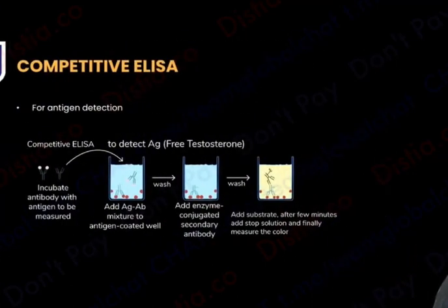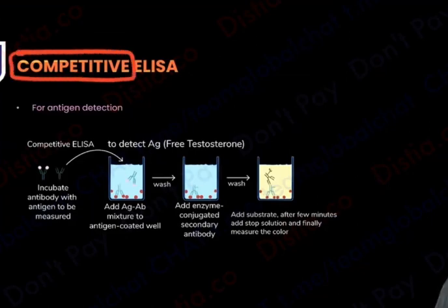Coming to the last one, competitive ELISA. This was also for antigen detection, but here I am going to create a competition. Competition means think of the topper of your class. He used to come to the class and say, "Arey, kuch nahi padha, I have not studied anything. I slept off yesterday. I had gone for a movie." But what was he doing? He was actually sitting locked in the hostel room and studying, or sitting in some library. So pehle se he has done his homework and come, hai na?